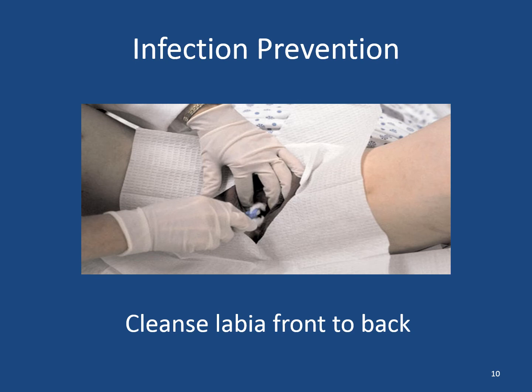And here you can see the nurse has one hand planted, spreading the labia, while the other hand is actually wiping everything. This is the technique that you will utilize for our female clients. The non-dominant hand is considered contaminated. Once it touches the client's skin, the labia must not be allowed to return over the cleaned meatus, even if it becomes slippery. So you really got to make sure you plant that hand and you do not move.